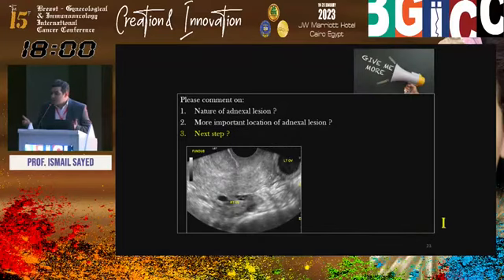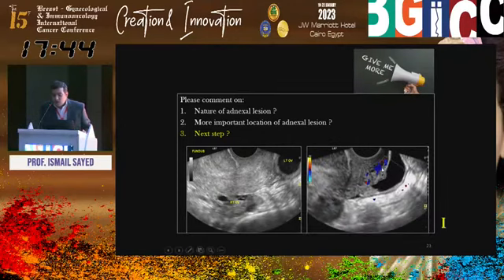What is your suspicion? If endometrioma is fixed, try to move it. Try to manipulate the transducer. If it is fixed, suspect deep infiltrating endometriosis. Ask for dynamic ultrasound. What is this structure? Gut signature. This is the rectum, yes, lower rectum, upper rectum.